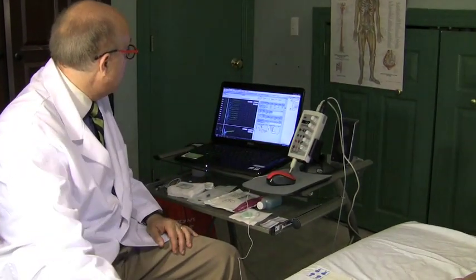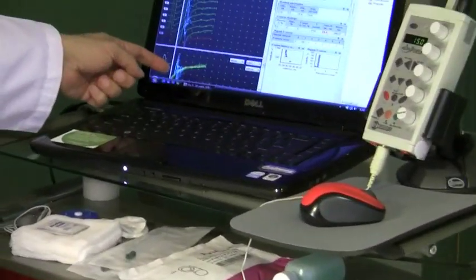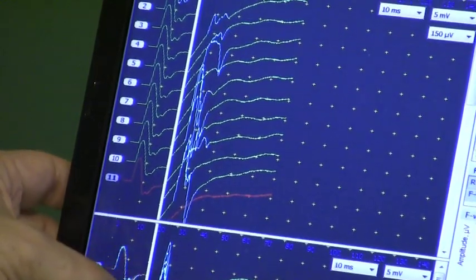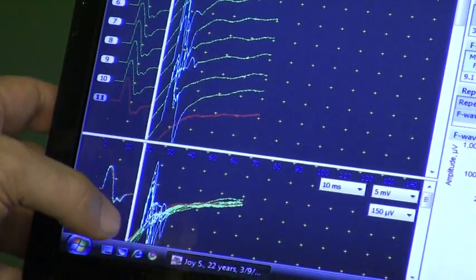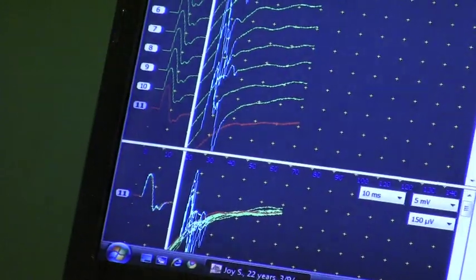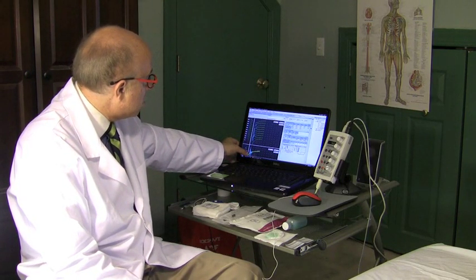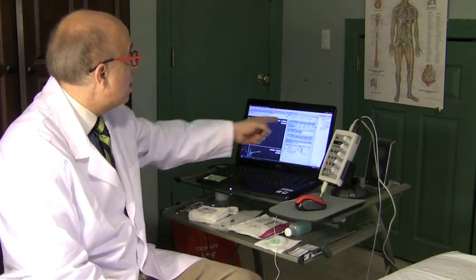So now I'm going to analyze them, and the computer now here has superimposed them. It just tells you that the shortest latency F wave is probably this one right here. The computer automatically measures it and gives you the shortest latency F wave. When we superimpose them, we can see which one is the earliest one and which one is the latest one. That's why we superimpose them, and the computer measures that automatically and tells you what it is.